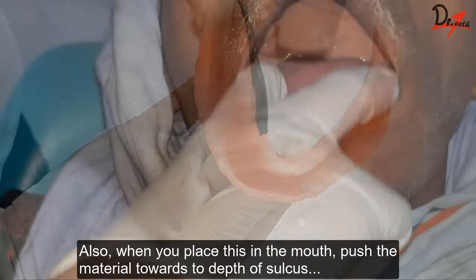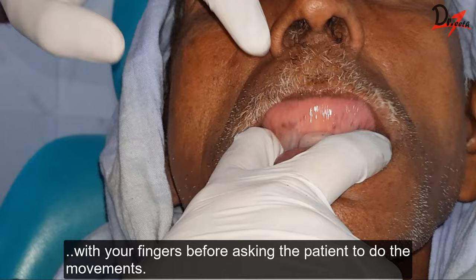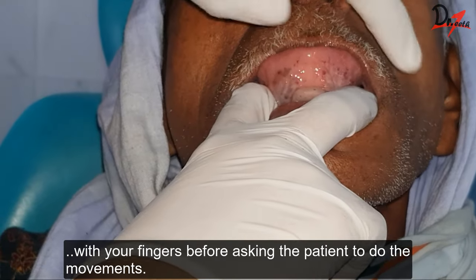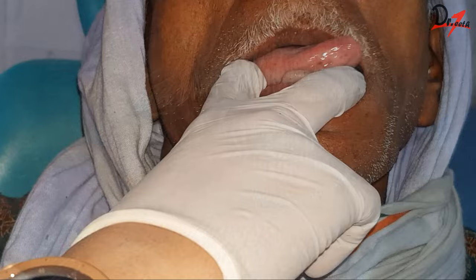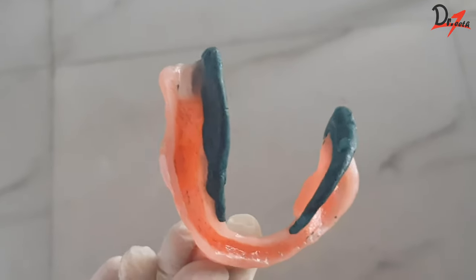Then put the tray in the patient's mouth and ask the patient to protrude the tongue and place the tongue in the distal part of the palate, in the right and the left buccal vestibules. The middle portion of the lingual flange is developed by asking the patient to protrude the tongue and lick the upper lip from side to side. After we are done with this, the distolingual and the middle flange will look something like this.